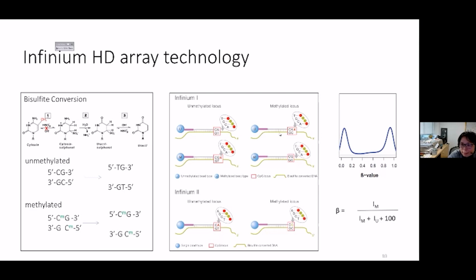This is the unmethylated design. The Infinium 2 design uses only one bead type, with the methylated state determined at the single base pair extension step after hybridization. The 3' terminus of the probe complements the base directly upstream of the query site, with a single base extension resulting in the addition of a labeled G or A, complementary to either the methylated or unmethylated state.